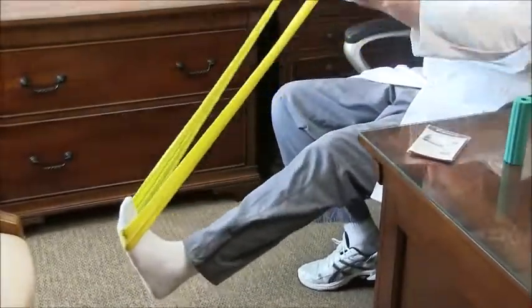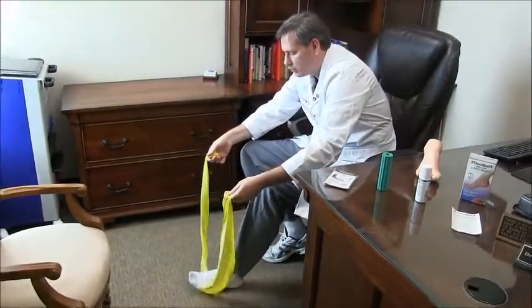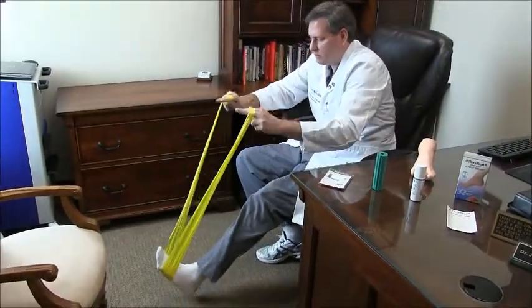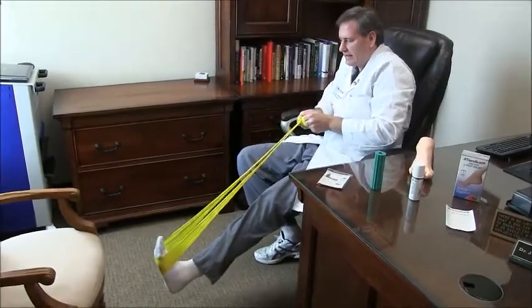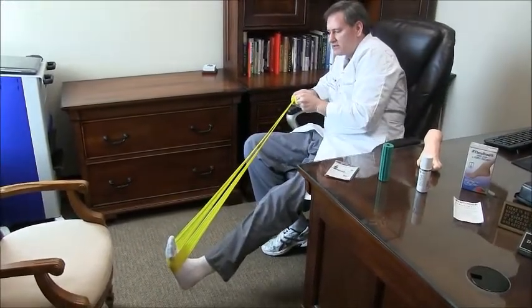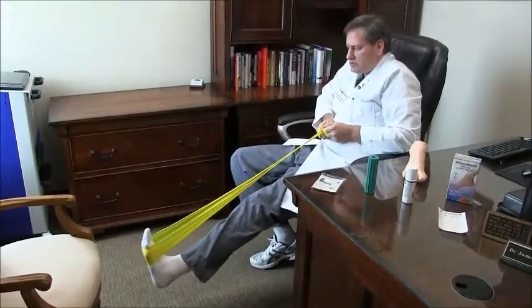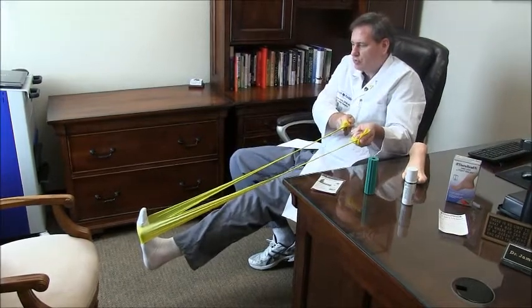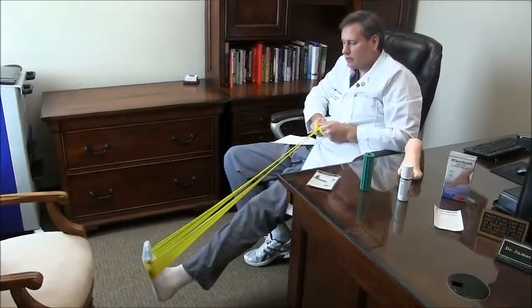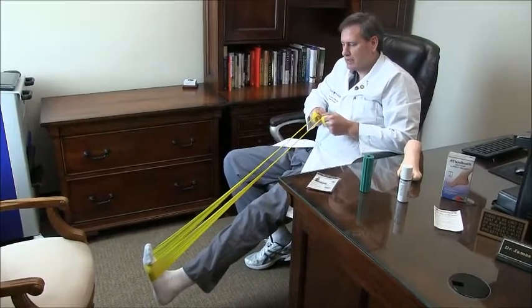Grab it like a horse's reins. Then I want you to really, really stretch that out. I recommend two minutes pulling medial to the midline, then two minutes using a straight line pull, and then two minutes using a lateral pull. I can really tell there's a lot of pull in my plantar fascia now, and there's a lot of pull around my Achilles tendon.